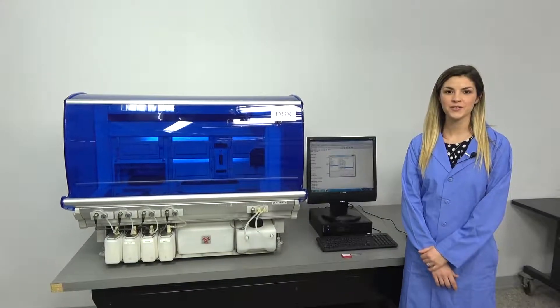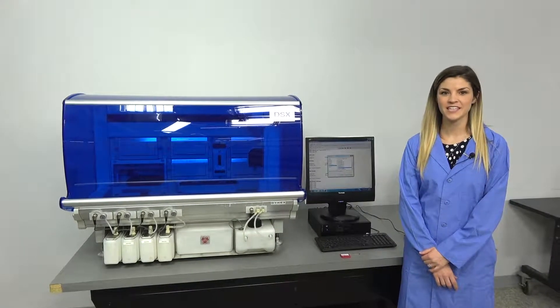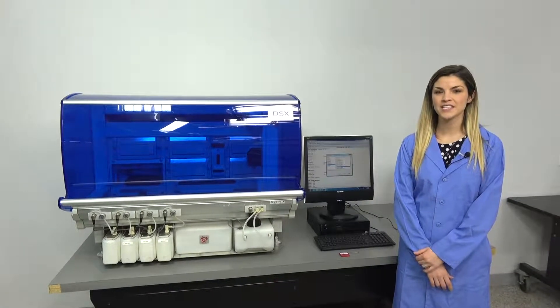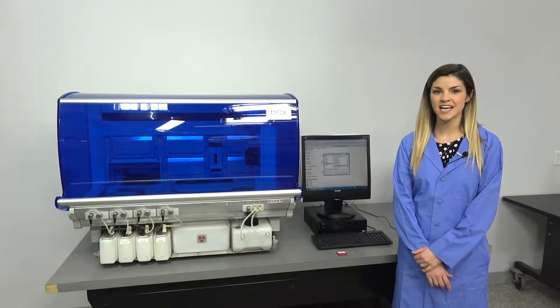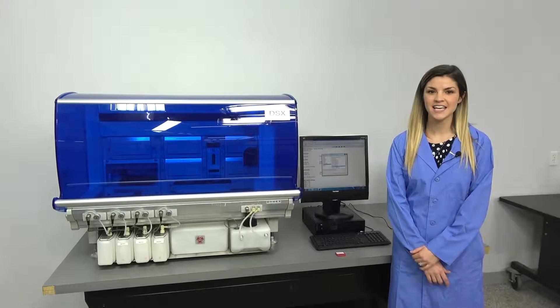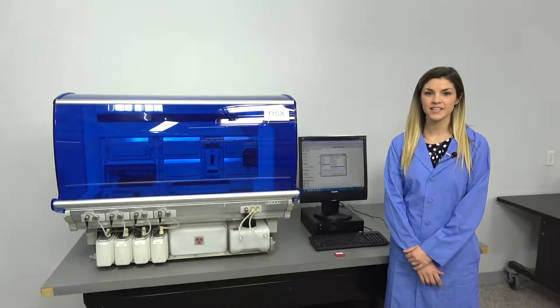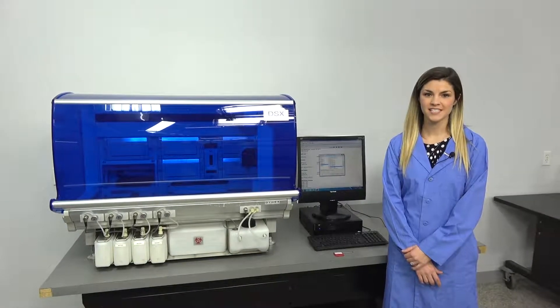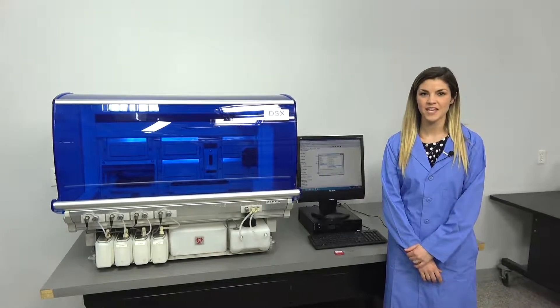Hi, I'm Heather with New Life Scientific, and today I'm going to tell you about the Dynex DSX ELISA processing system.